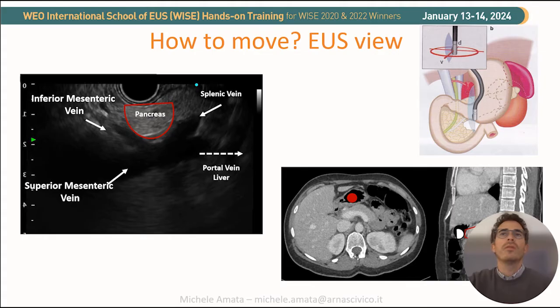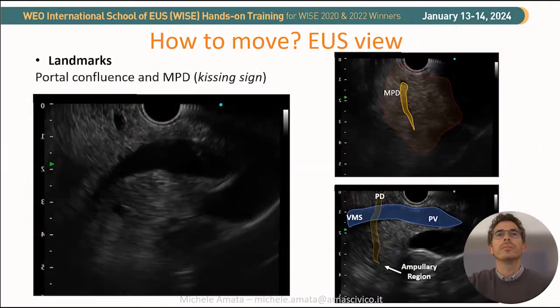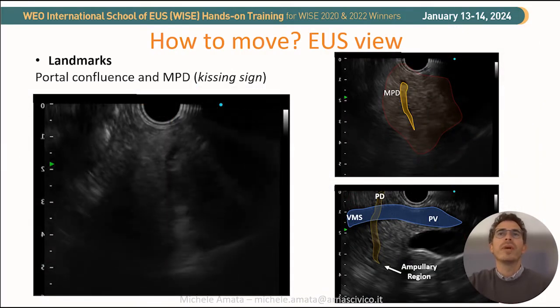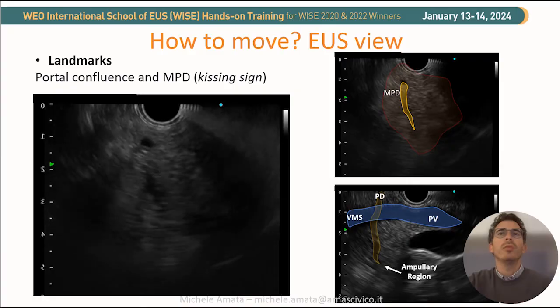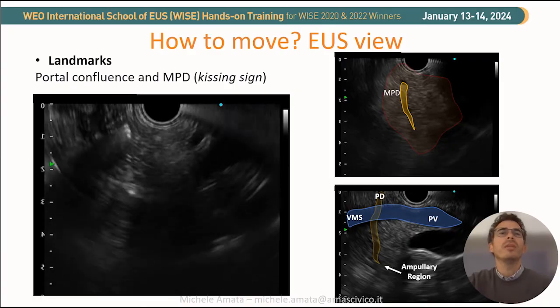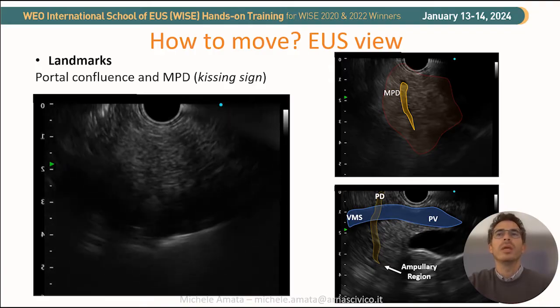Our position will be oriented to the right, looking posteriorly. We need to find the EUS view with contextual visualization of the splenic vein, superior mesenteric vein, and it is possible also to see the inferior mesenteric vein coming into the portal vein at the bottom right. From this position we will interrogate the head of the pancreas, the Wirsung duct going to the ampullary region, and we will see the kissing sign — a characteristic US image created by the contact between the Wirsung coming from the body and from the ampulla.